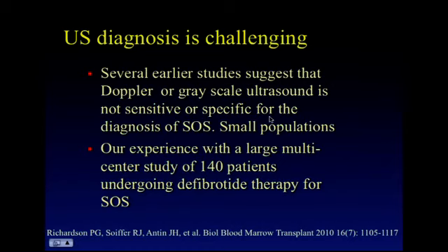So the ultrasound diagnosis of sinusoidal obstruction syndrome is challenging. There were multiple earlier studies that suggested Doppler or grayscale ultrasound wasn't sensitive or specific for the diagnosis of sinusoidal obstruction, but the problem was these were small population studies. So I'd like to share with you our experience with a large multi-center study of 140 patients who are undergoing defibrotide therapy for this very syndrome of sinusoidal obstruction. And here's the reference from our local group that performed the multi-center study.